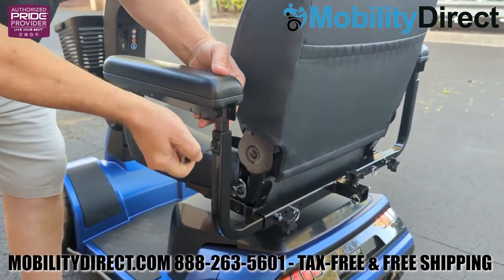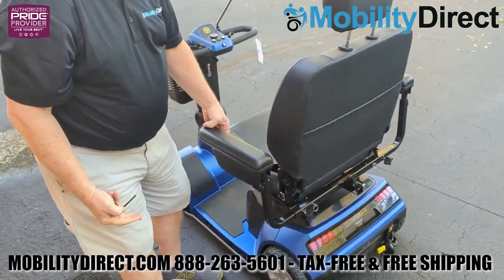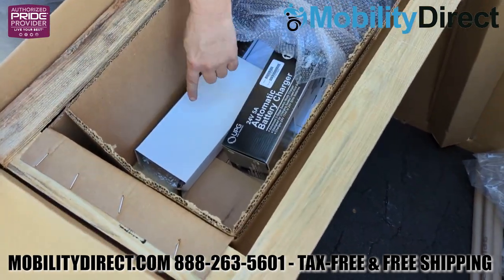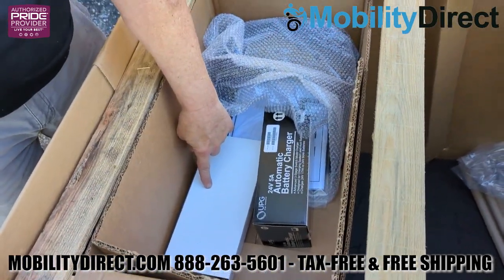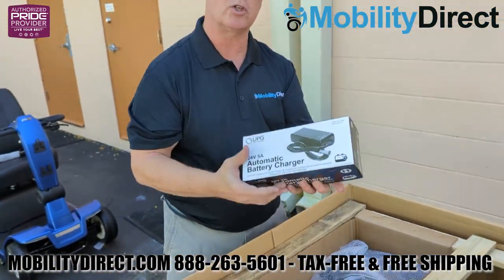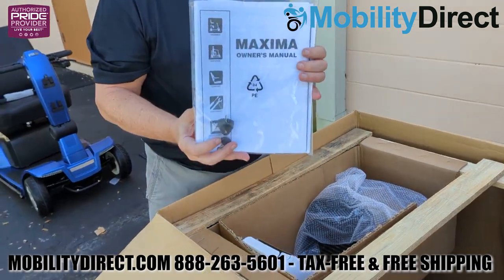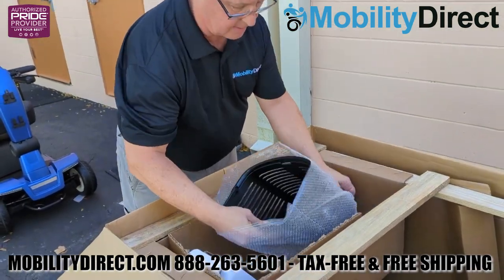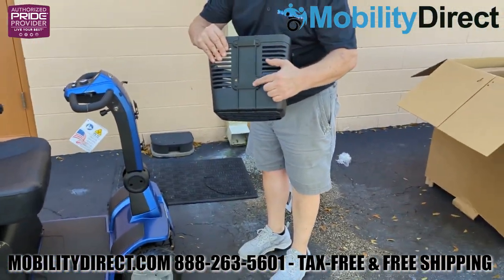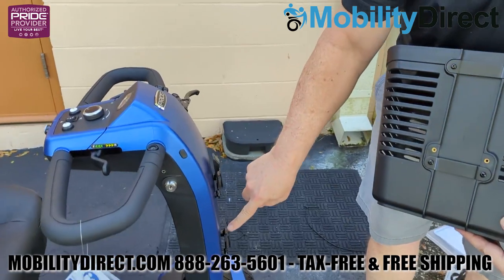Now we're going to remove some of the components that were in the box attached to the top part of that wooden frame, such as the charger, which is a 24 volt automatic charger. We're also going to find the user manual bag — you should read the user manual in its entirety. The keys are also in that bag. We're also going to take out the basket, which has two rails on the back, and on the front of the scooter there are two sets of hooks. You just slide the basket right onto the hooks and it connects.